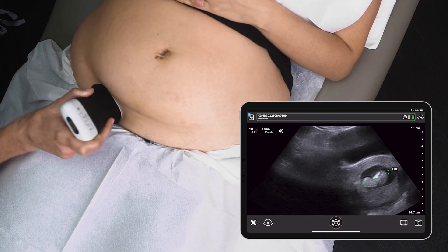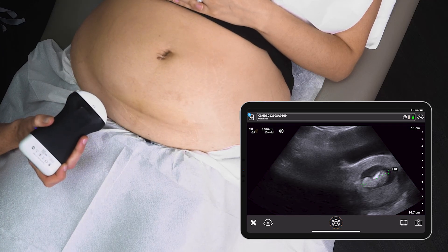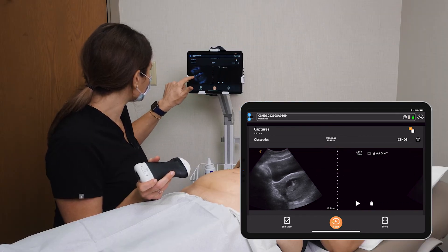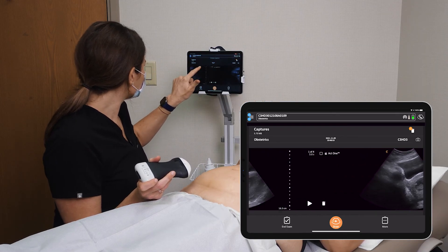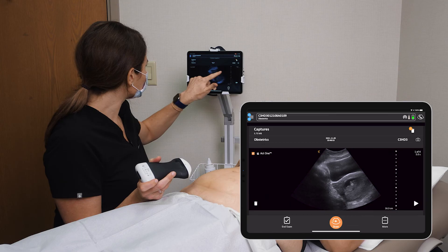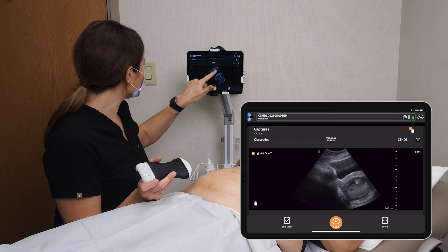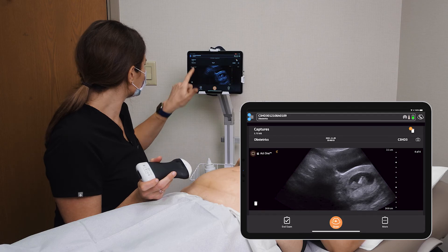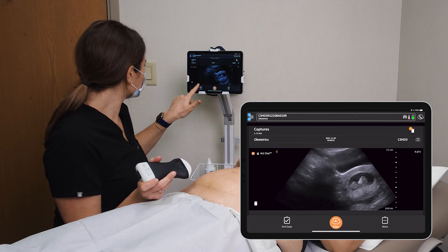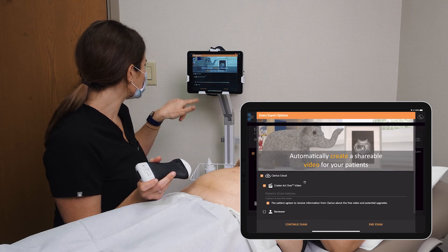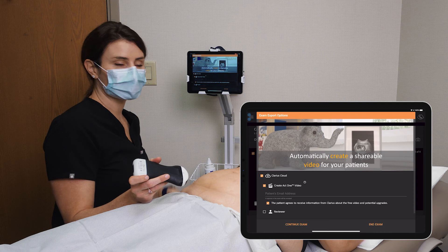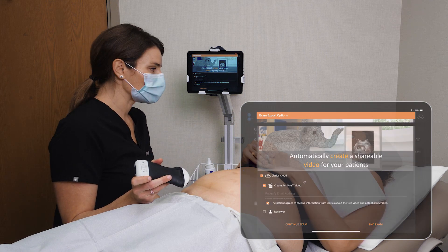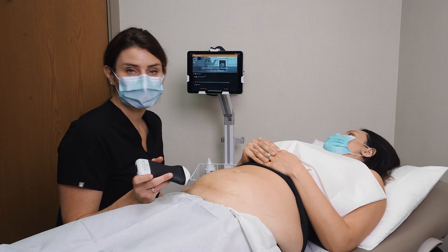Great, so we have some nice images there. Let's have a look and see which ones we like — we'll select a few, Lisa, and some videos, and then I can actually send them to you. I'll just get Lisa's email address and her consent, and then we can send her some images and videos from our visit today.